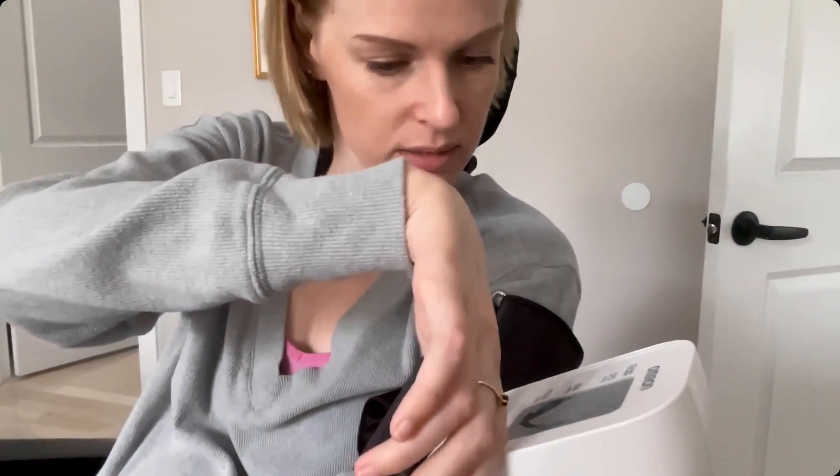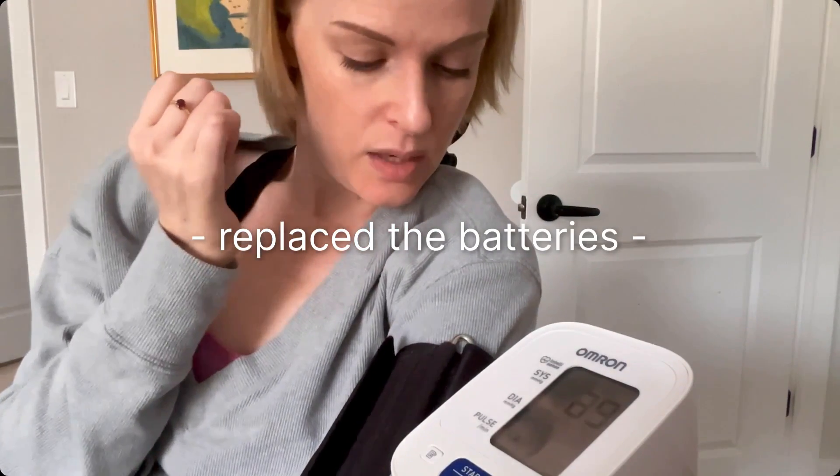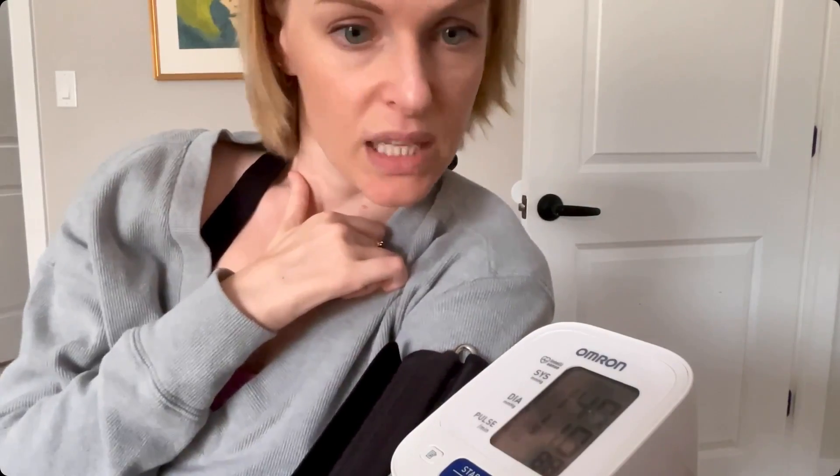Oh, are we out of batteries? What we're hoping is that I'm slightly elevated, and we can wait a little bit to see where I am in about a half hour, because I'm going to need to cath soon, so my blood pressure should slowly creep up. Okay, that's about right — I am 147 over 110.